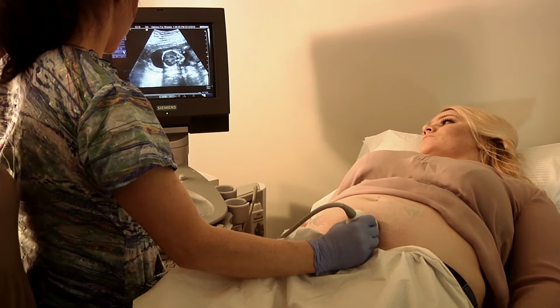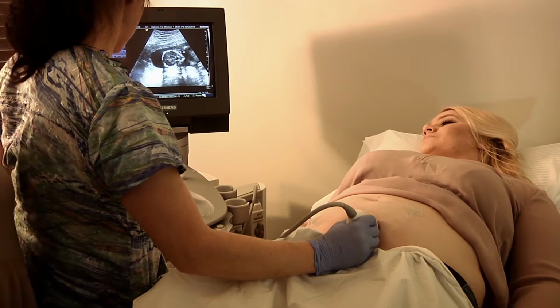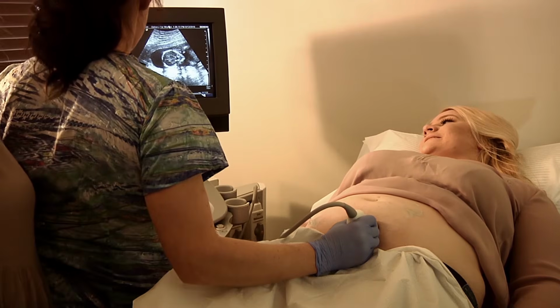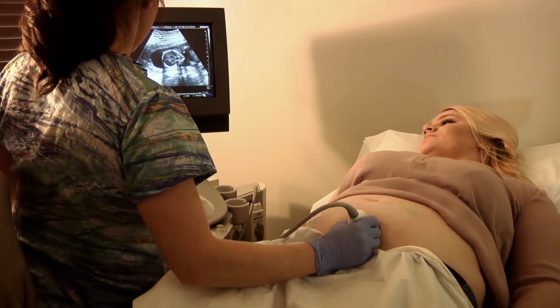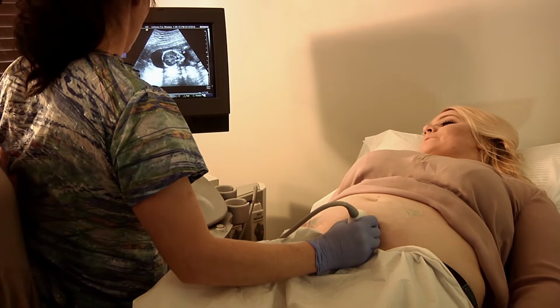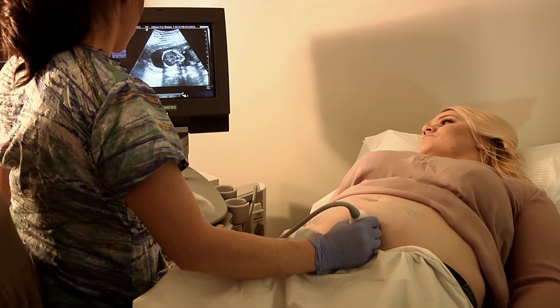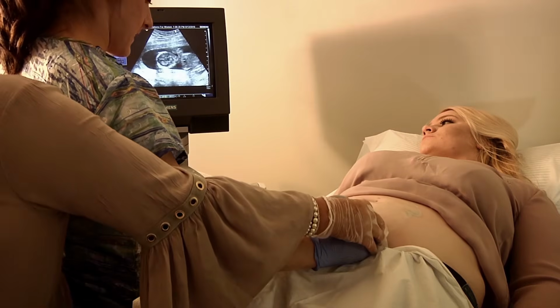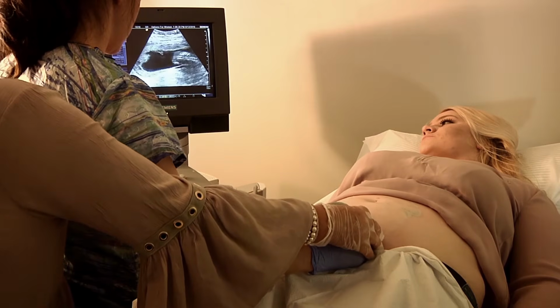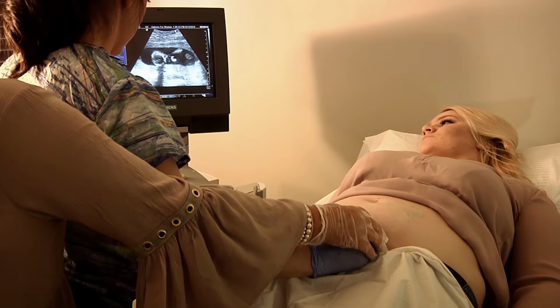Okay. And does it write? We're having technical issues with this machine. It's just not writing. So here, again, we would write sag midline upper, and then go ahead and take that picture. Now we're going to unfreeze. And then what you do is go from side to side. And here, see the fluid, and there's the face.